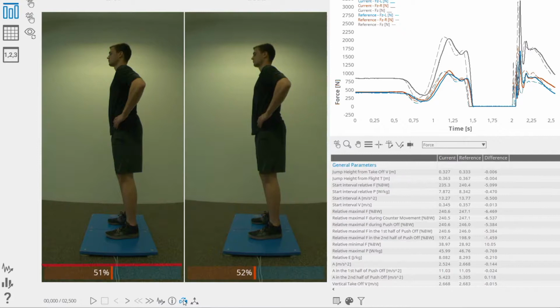The bars at the bottom of the videos represent the distribution of vertical force between the left and right plate. This is shown only in cases when a measurement was acquired with two plates. Force vector overlay is shown when acquired with a 3D plate and calibrated.